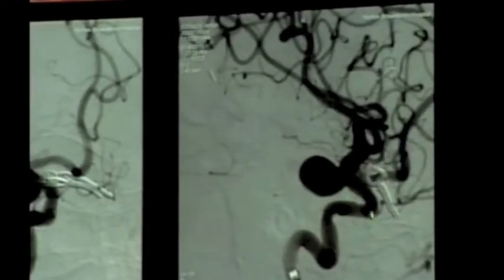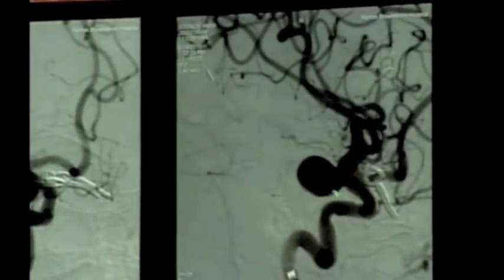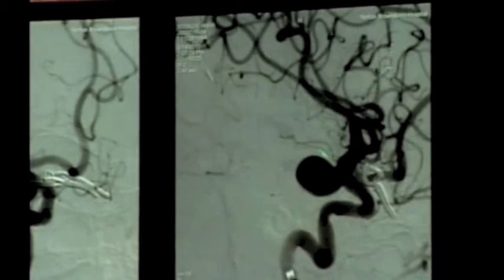Here we're looking at a two-dimensional angiogram of the carotid artery. You can see the carotid artery there and then an aneurysm fundus and the aneurysm neck.